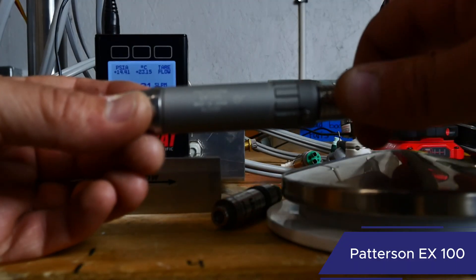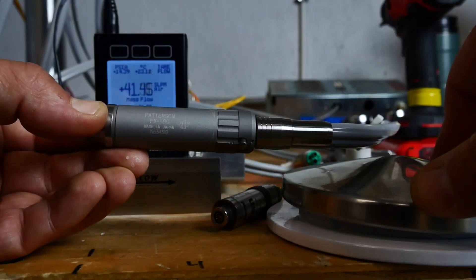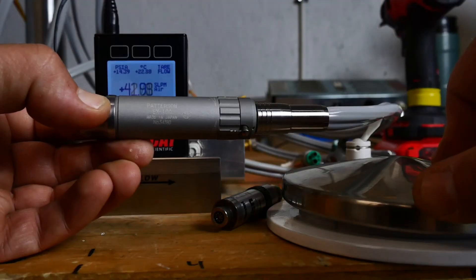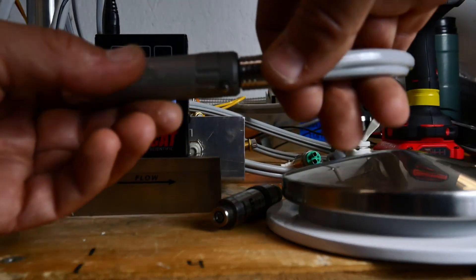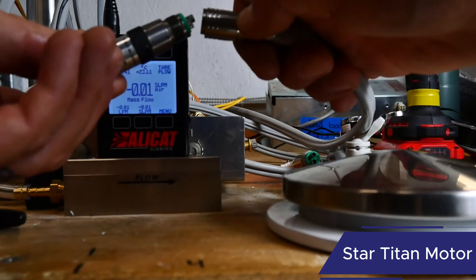This is the Patterson EX100. That's about 42 standard liters of air per minute — roughly 1.4 CFM.